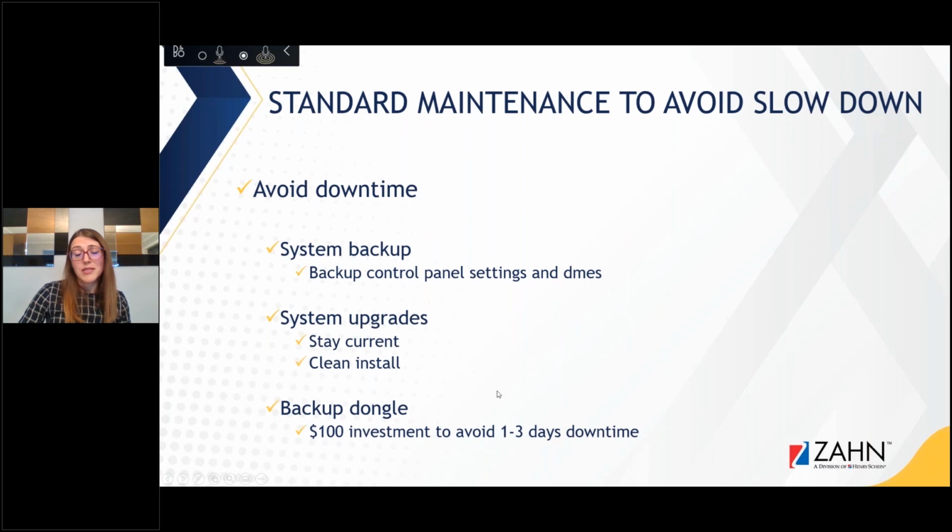A backup dongle. This is something that is a very easy safety thing to do. I don't know if this has ever happened to you, but it does happen frequently enough to where the investment is worth it. The dongle is your USB drive that you plug into the back of the PC. It's like any hardware, it can get damaged over time. It can overheat, it can get kicked, especially if you plug it into the front of the PC and it's accidentally damaged.